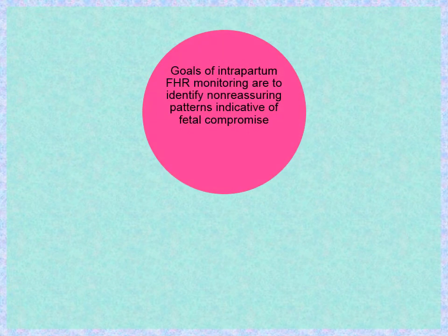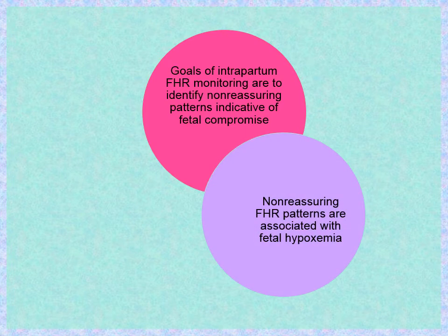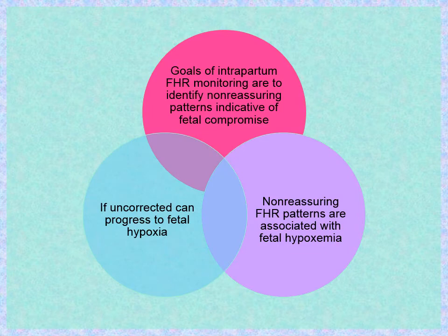The goals of intrapartum fetal heart rate monitoring are to identify and differentiate the normal patterns from the abnormal patterns which can indicate fetal compromise. Non-reassuring fetal heart rate patterns are associated with fetal hypoxemia. If uncorrected, these patterns can progress to fetal hypoxia.